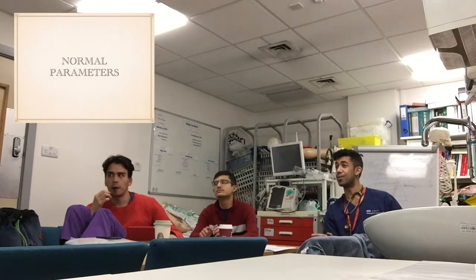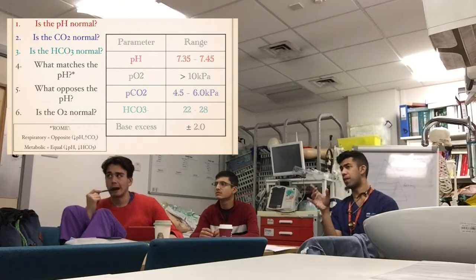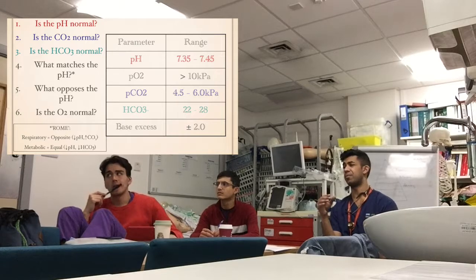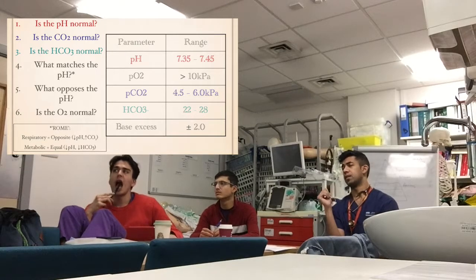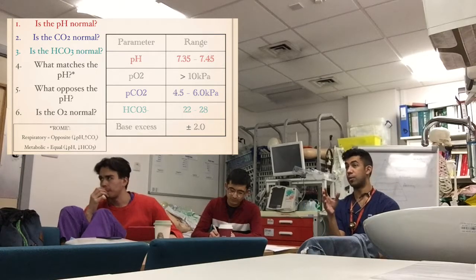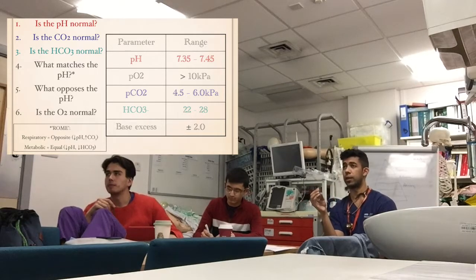Okay, fantastic. So first of all, what I'd suggest you do is write down the normal parameters, or be familiar with them, for a blood gas. The ranges are on the right. In particular, for the MCQs later on, you're going to want to know the normal reference values for CO2, bicarb, and oxygen. I suppose the pH as well, really the whole shebang. If you want to take a picture of the slide, that might be a good idea, because then you have an approach for interpreting a blood gas.